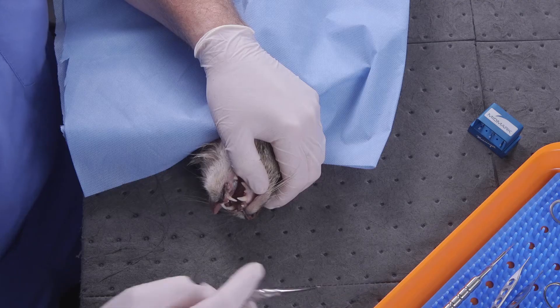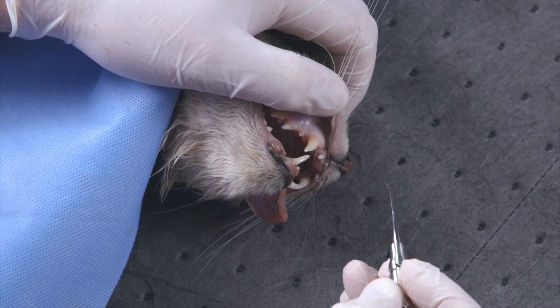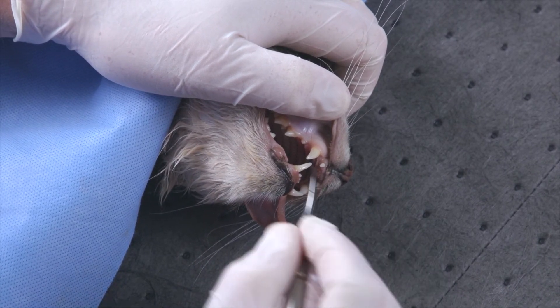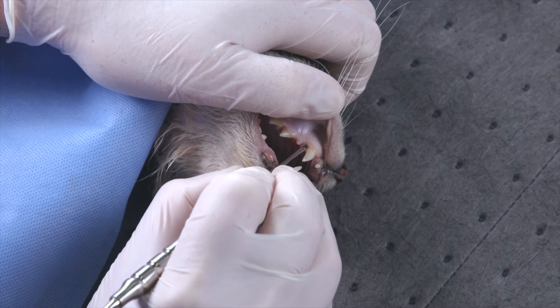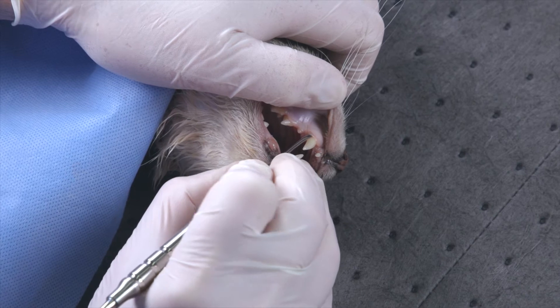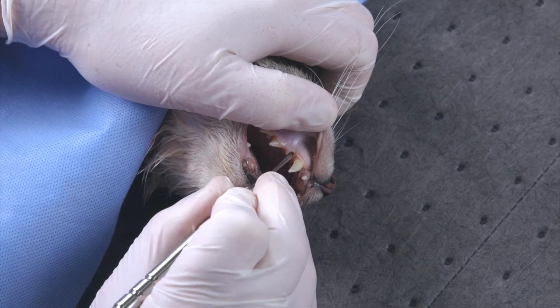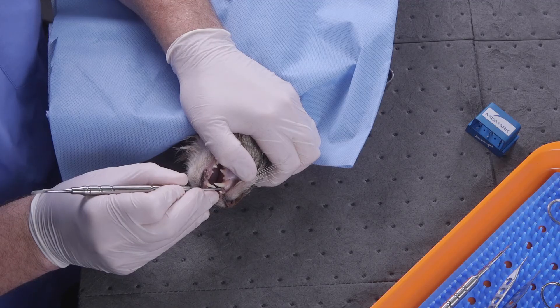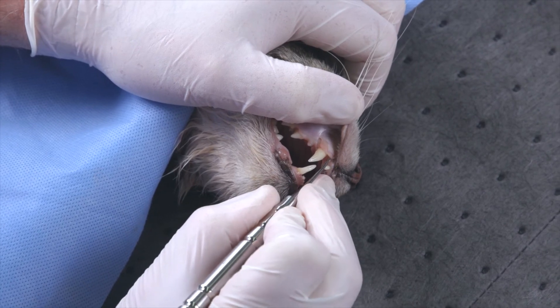Now using the Syndex periosteal elevator, I'll begin using the small end to begin the periosteal elevation. I'm going to take my time, keeping the sharp blade onto the hard tissues the entire time, using small movements here in the cat mouth, to gently peel and pry this tissue away from the bone and away from the tooth. Getting the corners peeled away is done nicely by taking the time with this freshly sharpened blade.